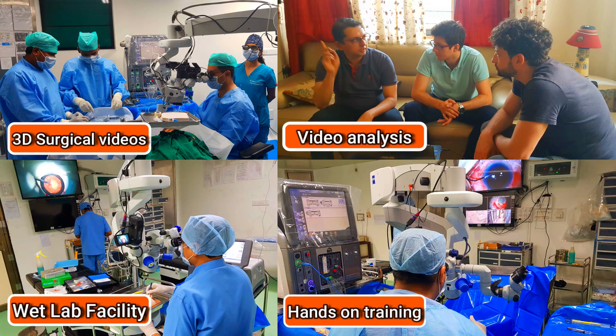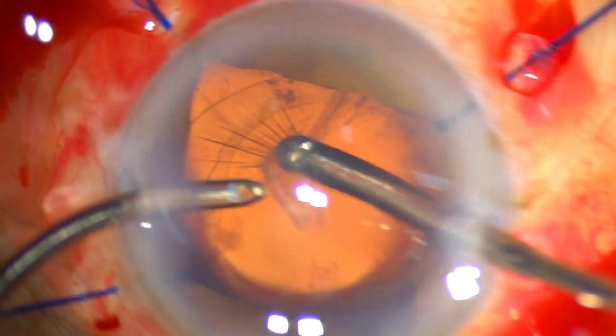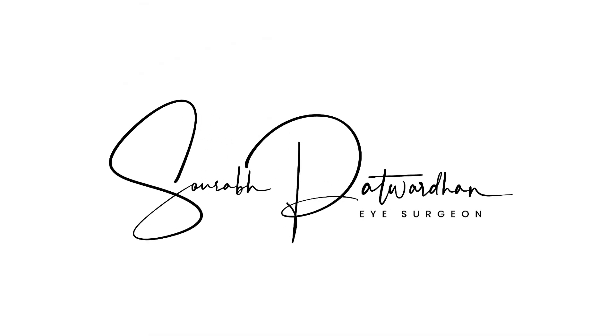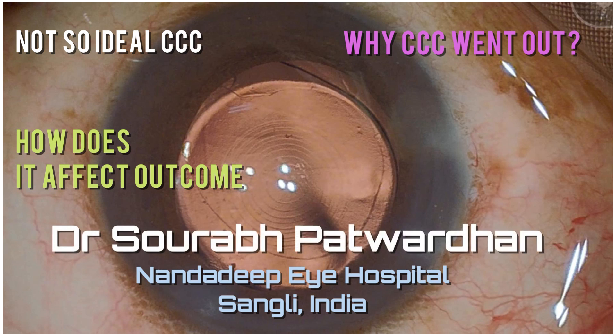In our center, we have a lot of teaching activities which includes hands-on training as well. In this video, I will be speaking about a case where CCC is not so ideal, why the CCC went out and does it really affect the outcome?